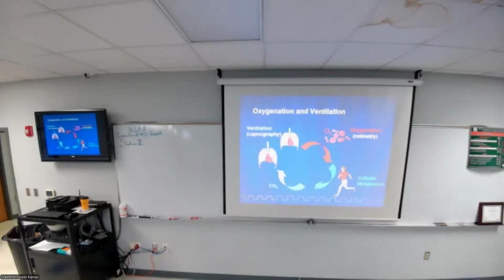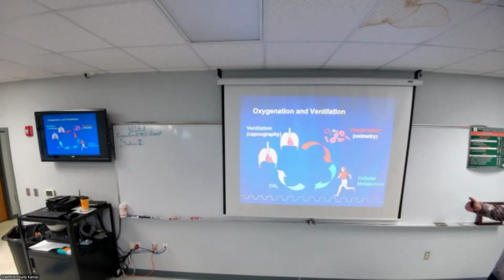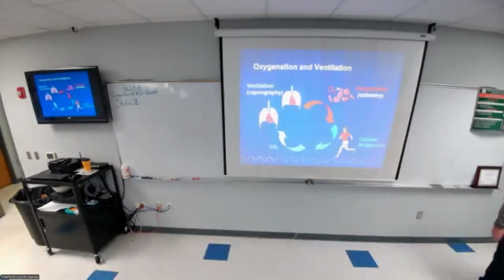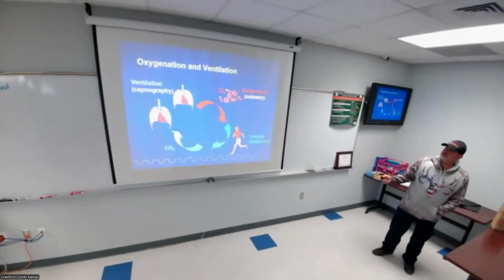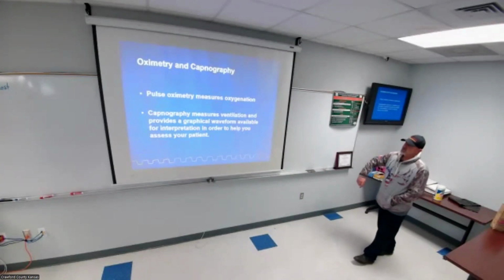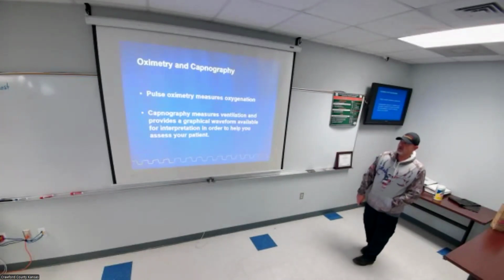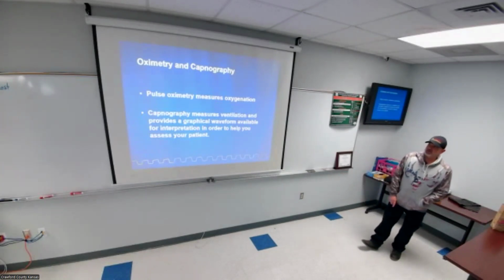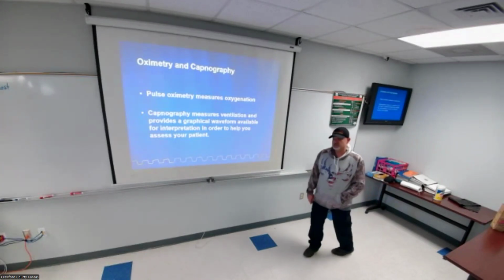I'm sorry. All right, so here's just like a little ventilation comes in, goes around. We have the cellular metabolism, comes back out with the CO2. All we do is trade out oxygenation for trash. Pulse oximetry measures oxygenation. Capnography measures ventilation. It provides a graphic waveform available to interpret in order to help you assess your patient.